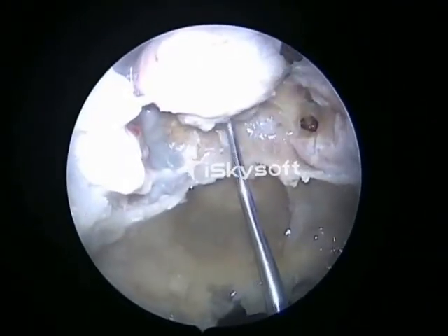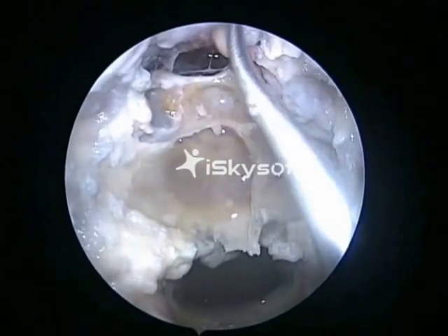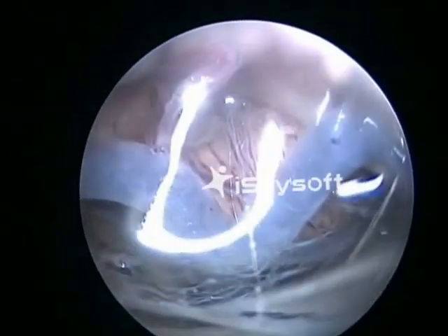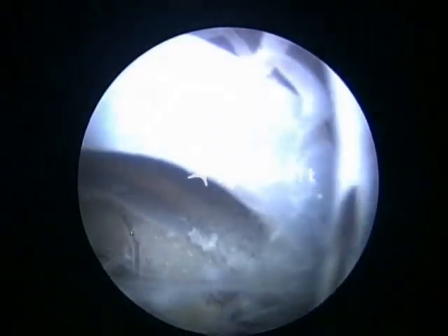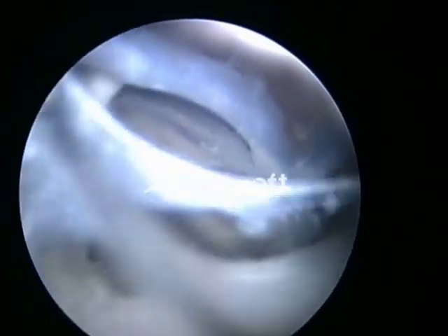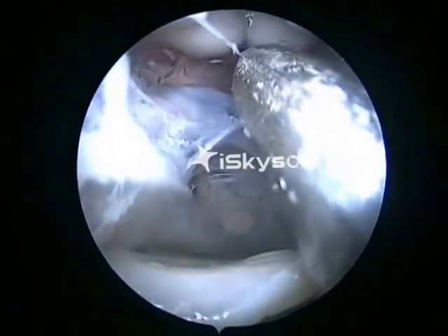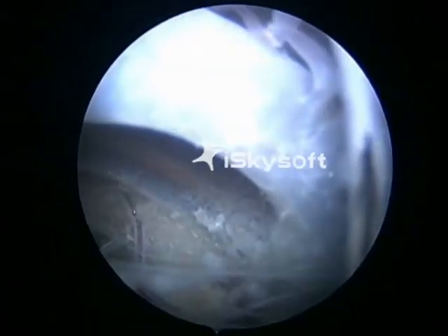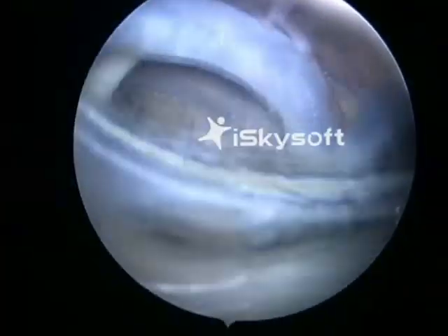The next step would be having a glimpse into the upper clivus using a 30-degree telescope, looking from above downwards. We are able to see the posterior cerebral and the superior cerebellar artery and the basilar artery there, the third nerve on the left of your picture. Once we suck the CSF, we are able to see the third nerve very clearly, the posterior cerebral artery there, the basilar artery there, behind the dorsum sellae.